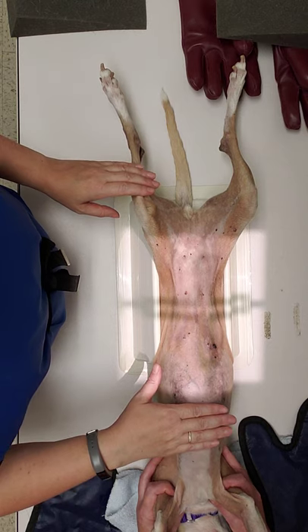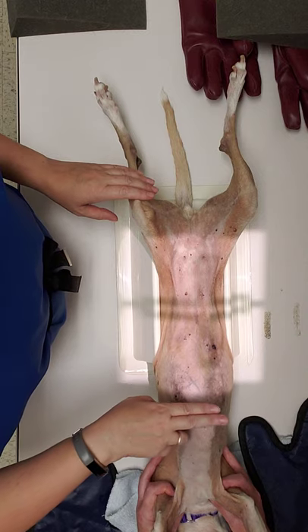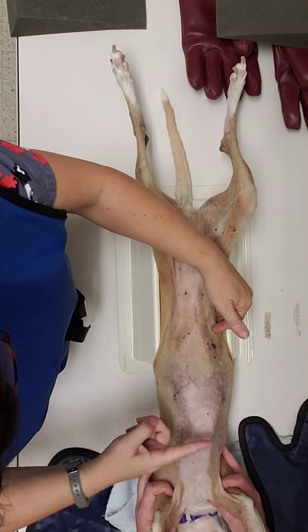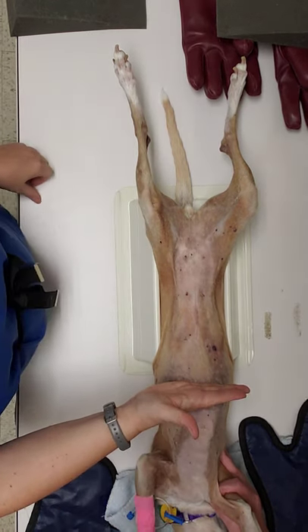Your cranial border is going to be about two fingers — two inches worth — roughly below her xiphoid process. It's still going to equal out to about the ninth rib. So if you look back, here's her thirteenth rib, here's her xiphoid process, about halfway in between if you count them out — it's still going to fall about right here.